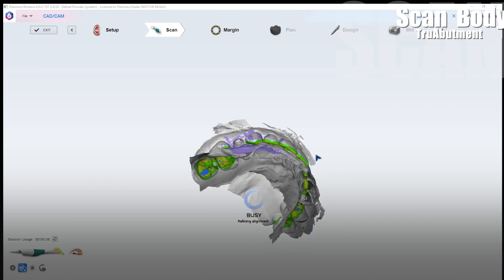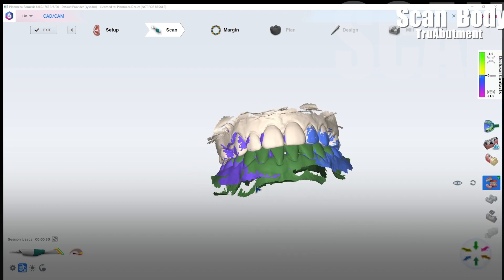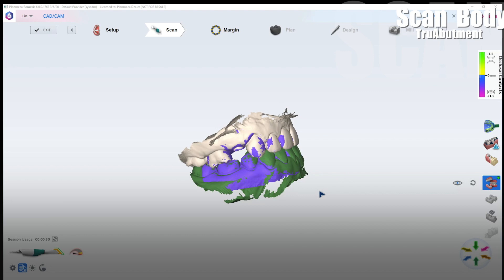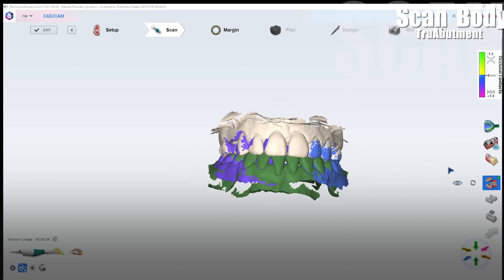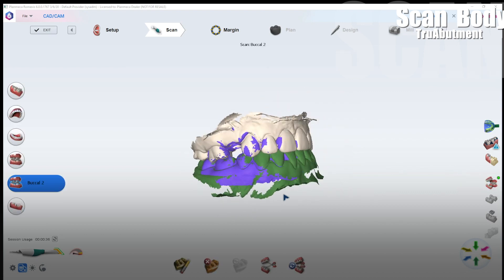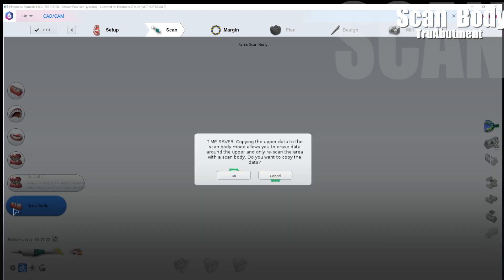And that's the best way to get an accurate cross arch mount of these models is through the bilateral bites. If you're doing just a single quadrant you probably definitely don't need two bites. And also it's not wise to take two bites at different occlusal schemes like one in MIP, one in CR, one closed, one open.